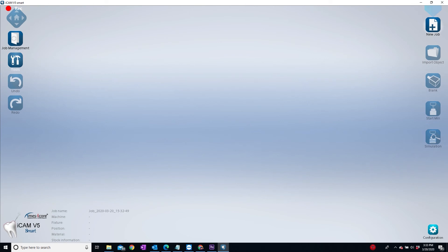Some of the buttons are contextual, meaning if you don't have an object on screen, then they will be of no use to you. The move button in the upper left-hand corner is grayed out because there isn't an object on screen, the same as the undo and redo buttons.